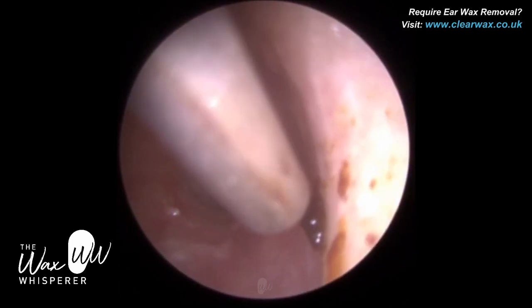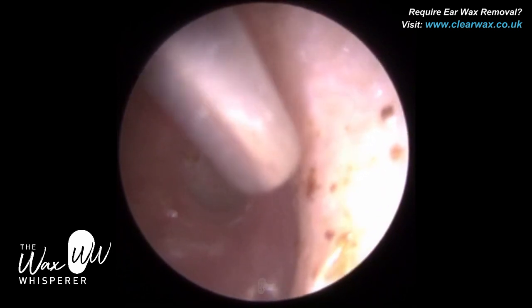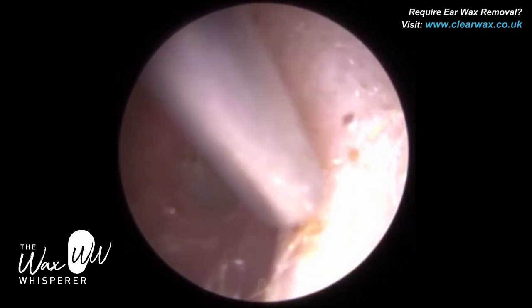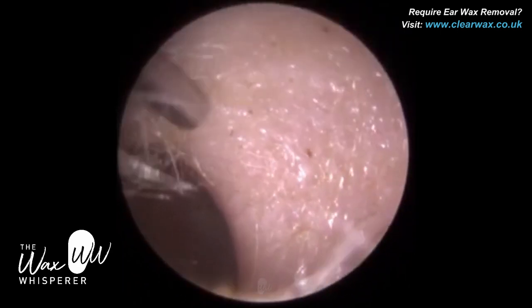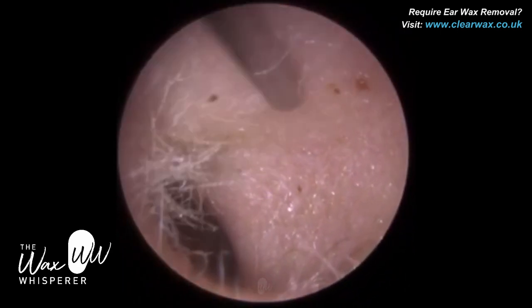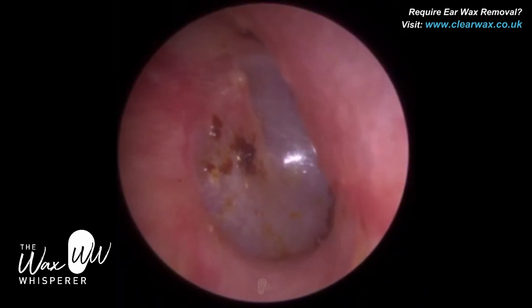The wax was a bit stubborn there, so I hovered over it. It wasn't budging, so I just left that behind — that's not going to cause the patient any problems whatsoever. As the skin dies and sheds from the eardrum, it will migrate outwards. We call that epithelial migration of the ear canal, and that wax will naturally migrate out.